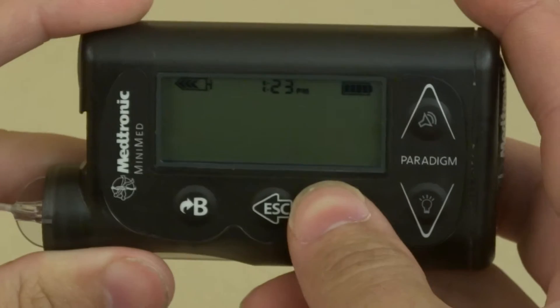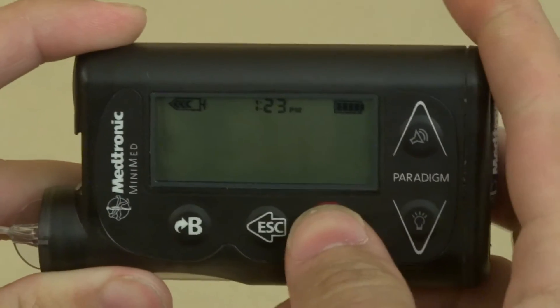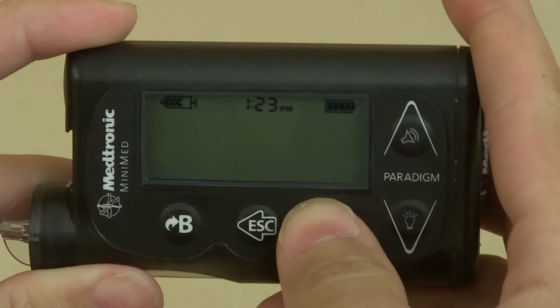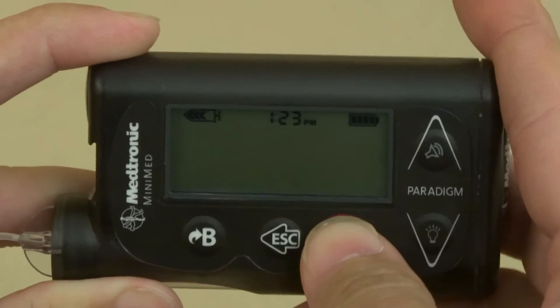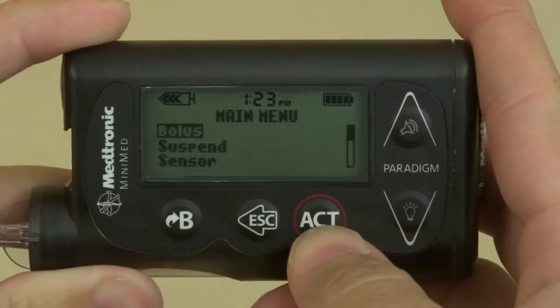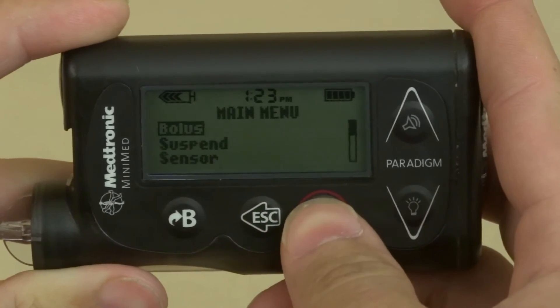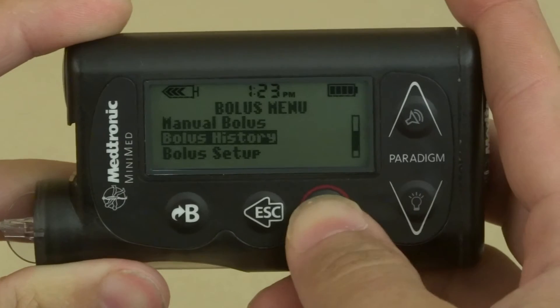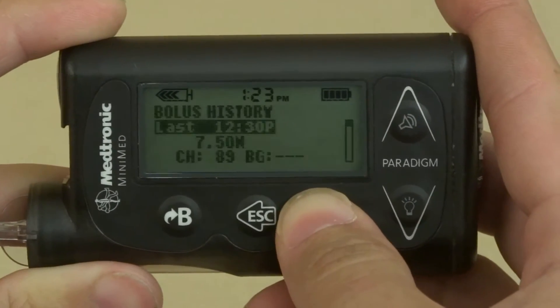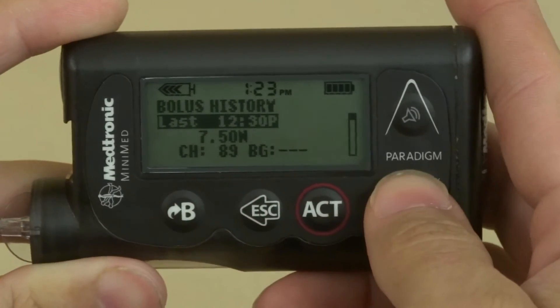To find if you missed a bolus at a meal or a snack, all you do is hit act, hit act again once bolus is highlighted, and then scroll down to bolus history, and it will give you your last bolus.